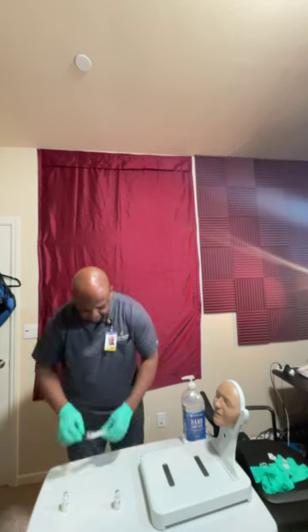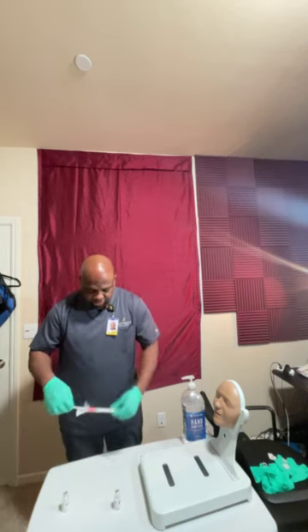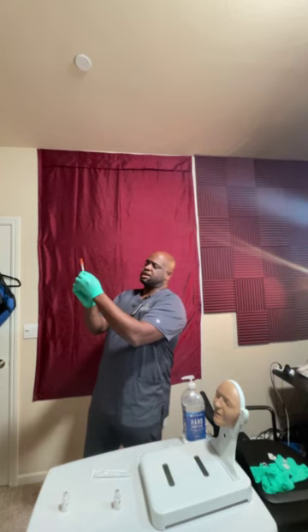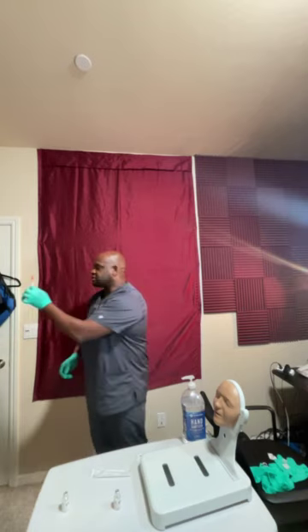And from there, with the cap still on, I'm going to first draw up 8 units of air. With the cap still on, 8 units of air. There's 5, 6, 7, 8 units of air. Okay, making sure that is there. Yep, 8 units. Okay, I'll show it to my fellow nurse. 8 units of air. I show it to you guys. That's 8 units of air.